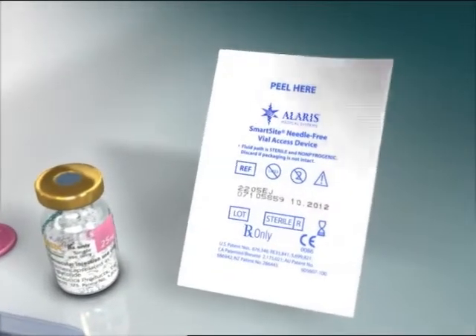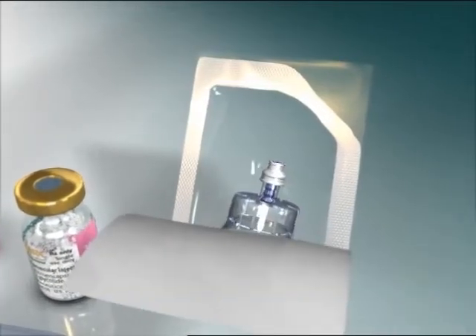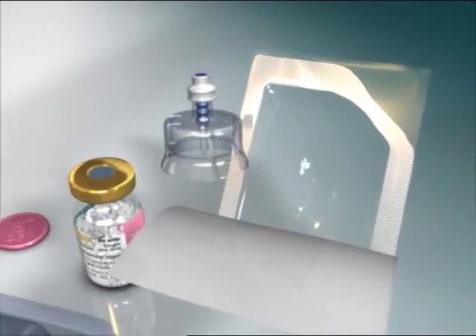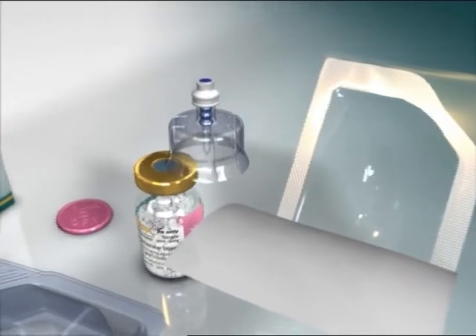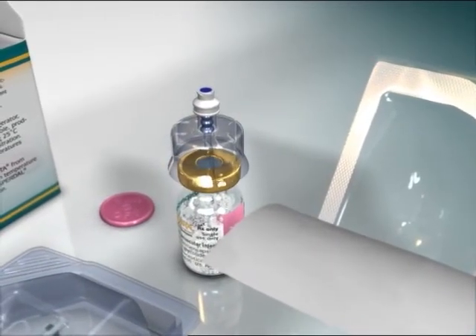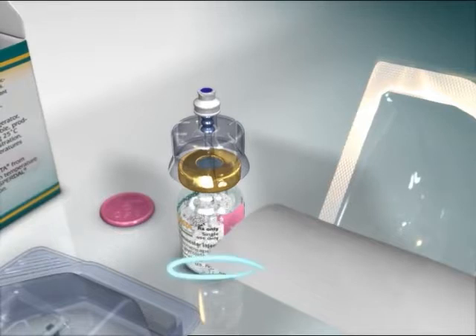Peel back the blister pouch of the SmartSite needle-free vial access device. As you remove it, hold it by the white luer cap. Do not touch the spike tip of the access device at any time. Place the vial on a hard surface and hold the base of the vial. Orient the SmartSite access device vertically over the vial so that the spike tip is at the center of the vial's rubber stopper.